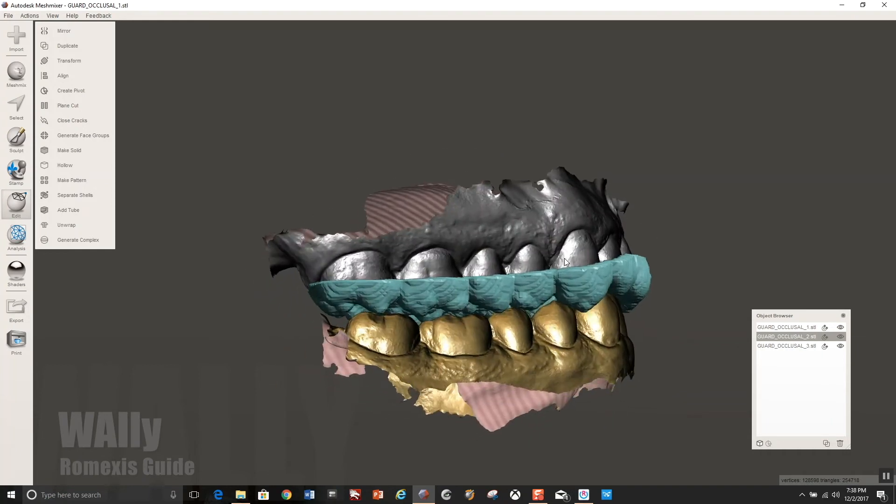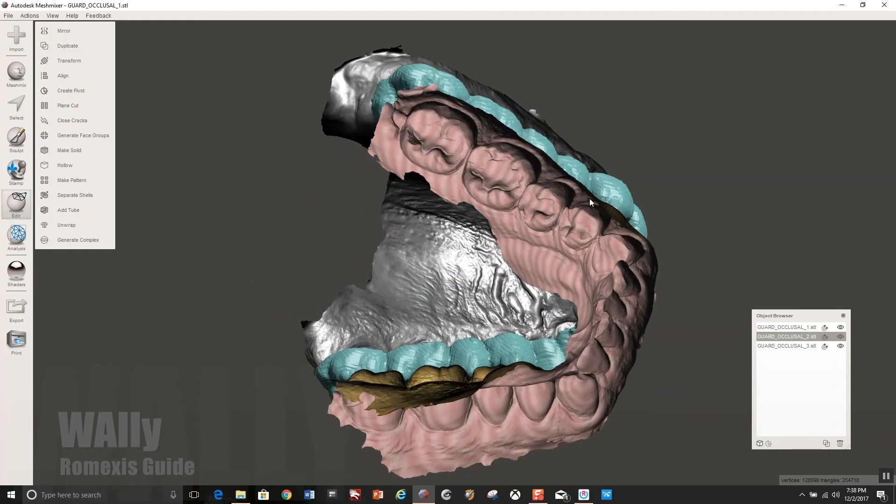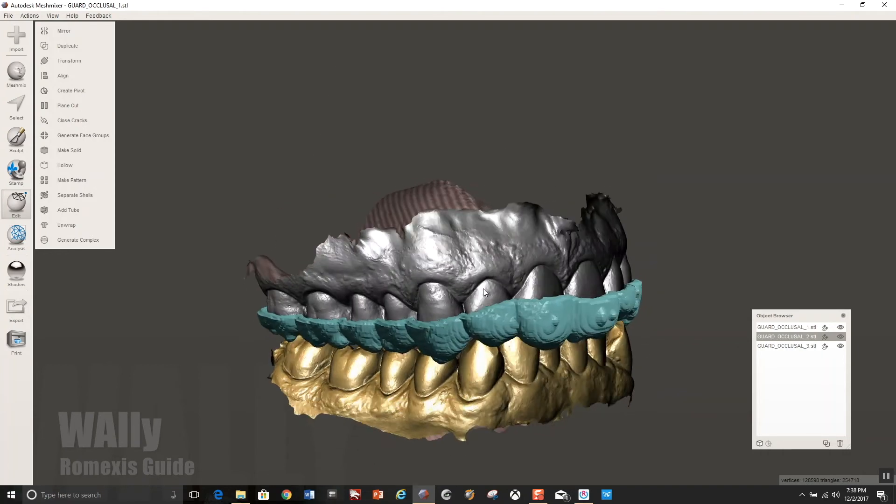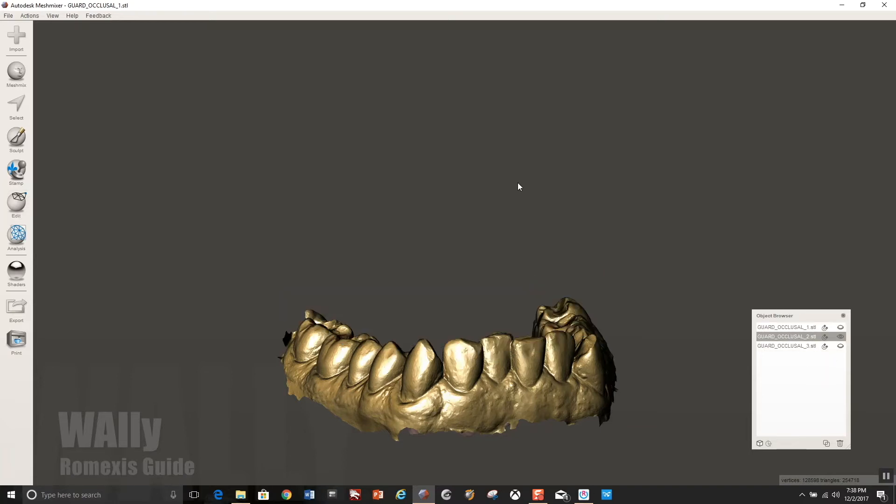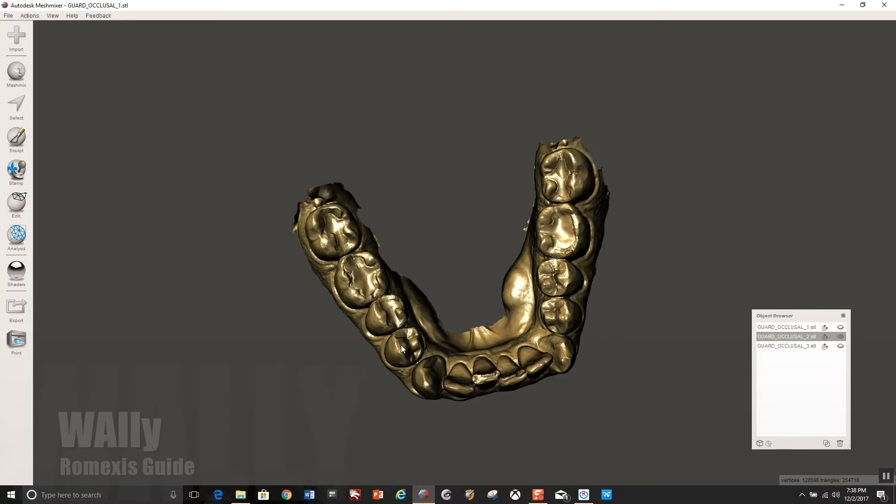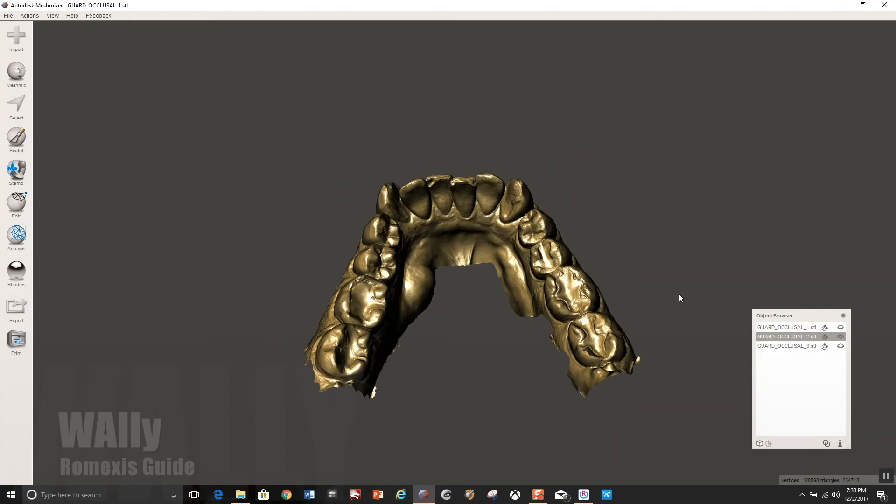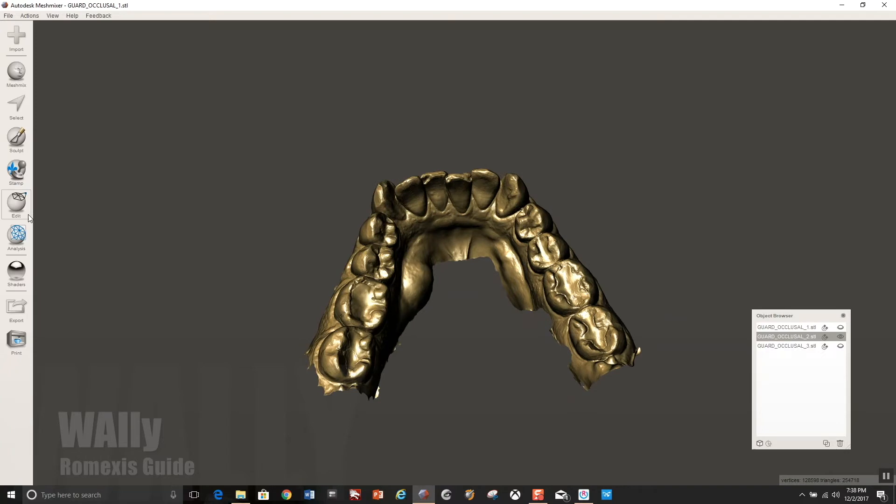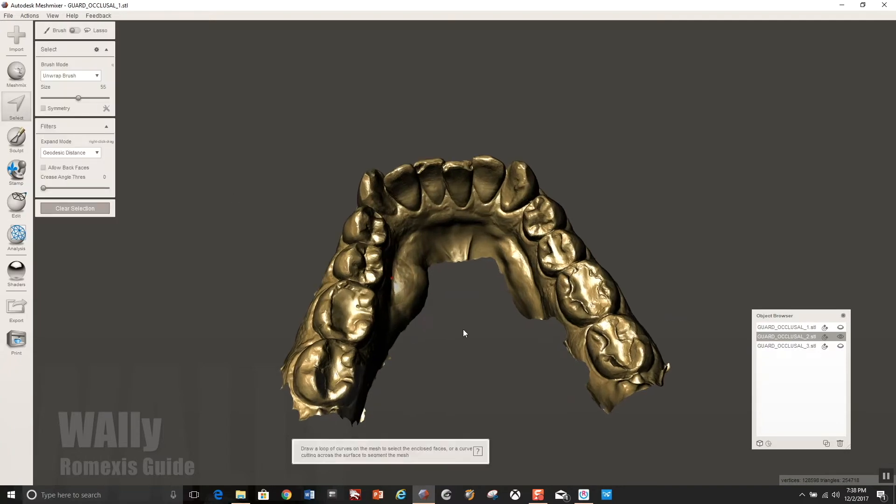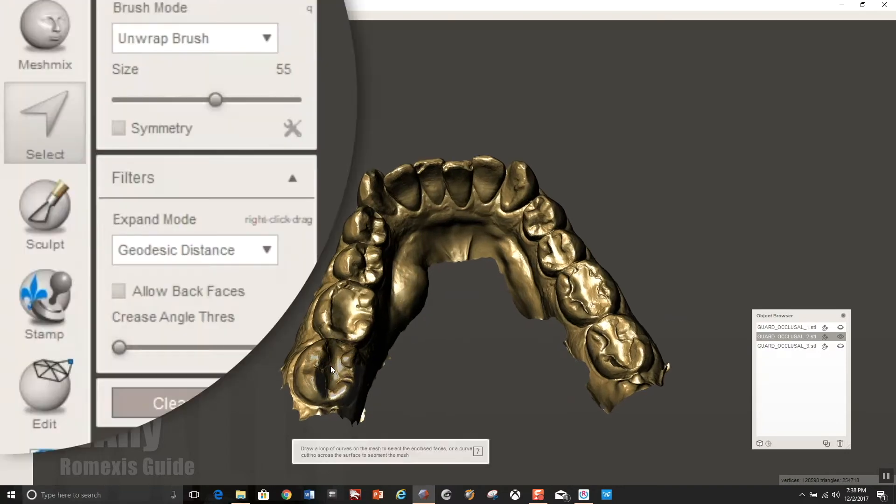And so here we have it imported. The bite is everything comes in as it was imported into Rimexis. So now what you need to do is you need to alter the mandibular model in such a way that the guide, when it fits down to it, won't be convex into the central fossas because we don't want to lock the patient in.